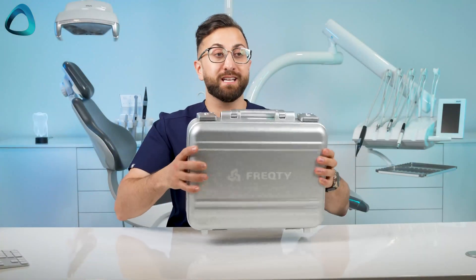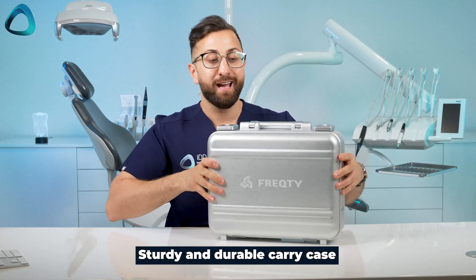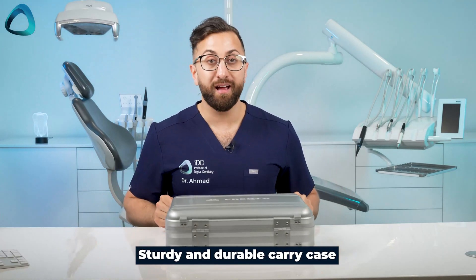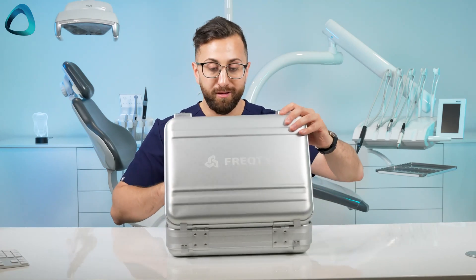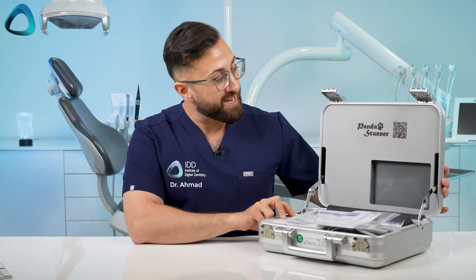First things first, it comes in this hard metal case. We open it up — it does have a locking mechanism and we click these open. I feel like I'm opening kind of like a case of money or something.